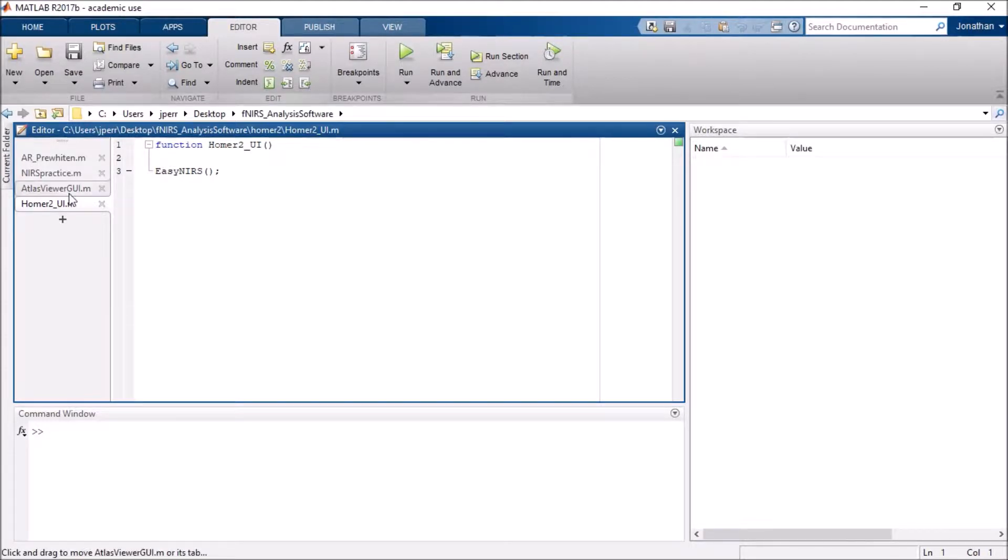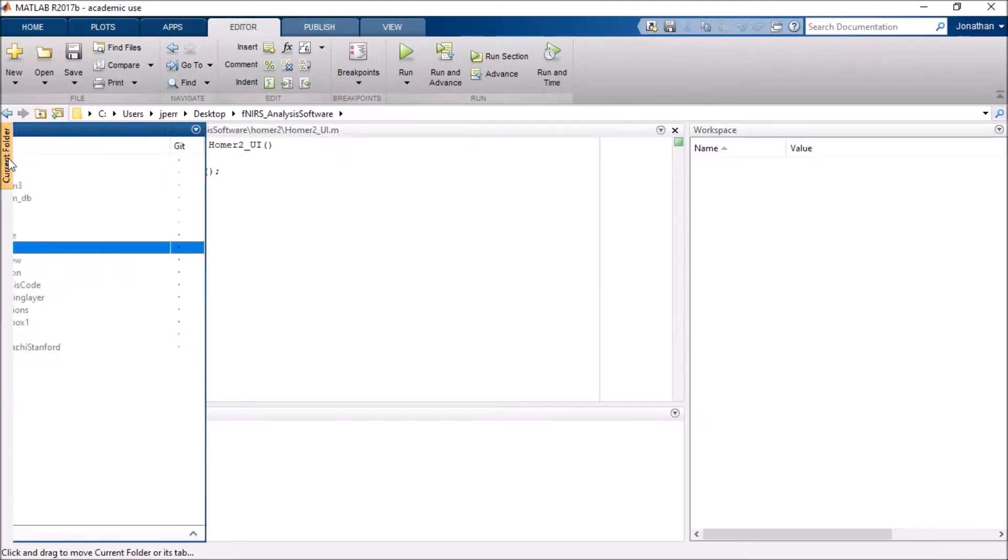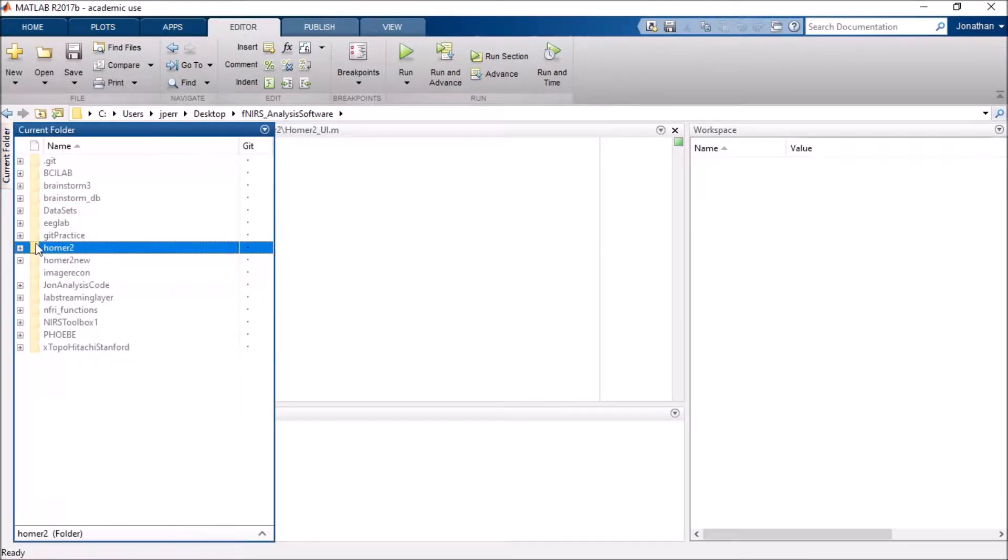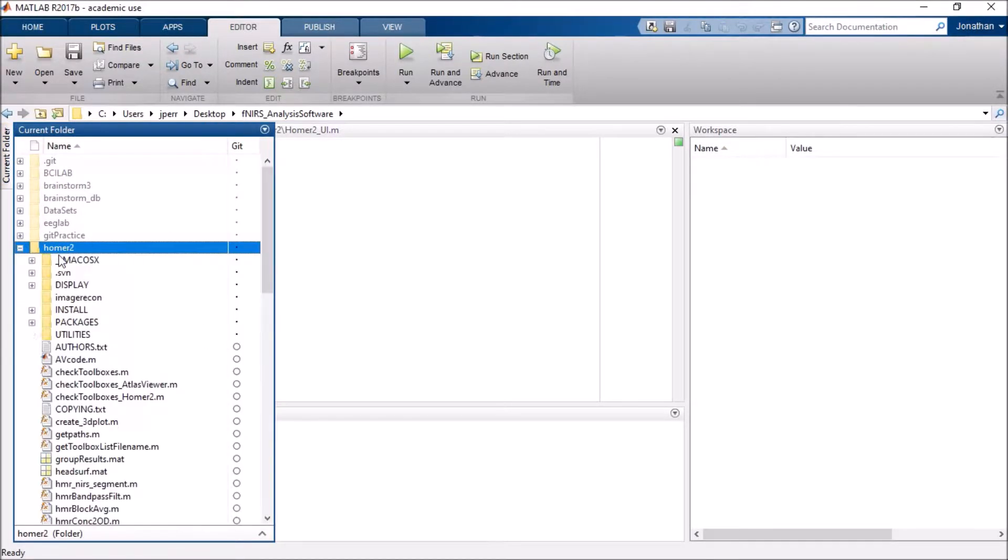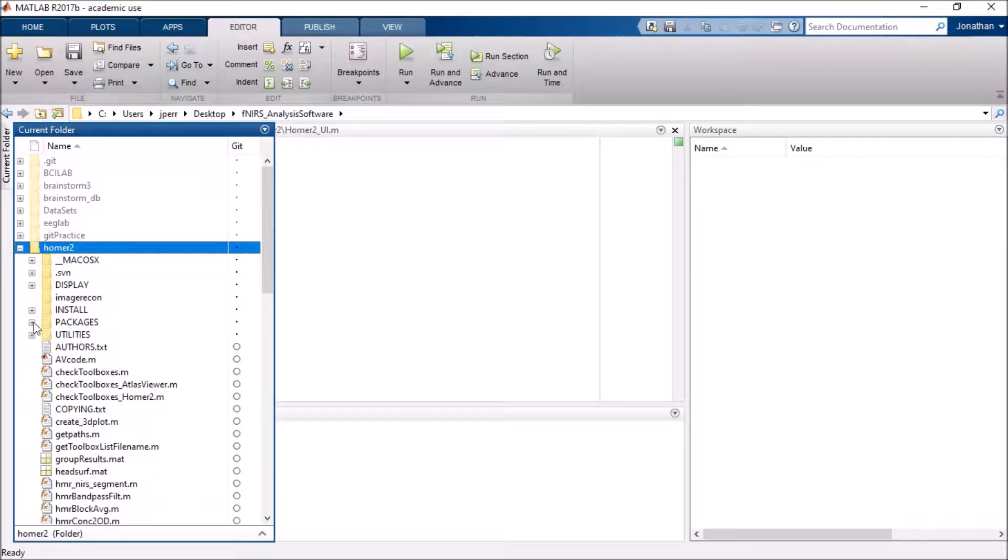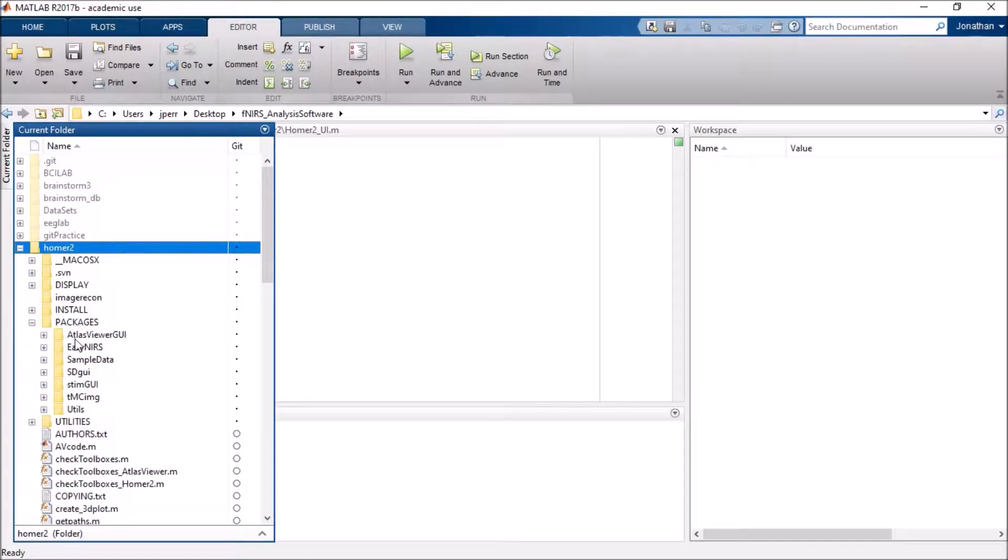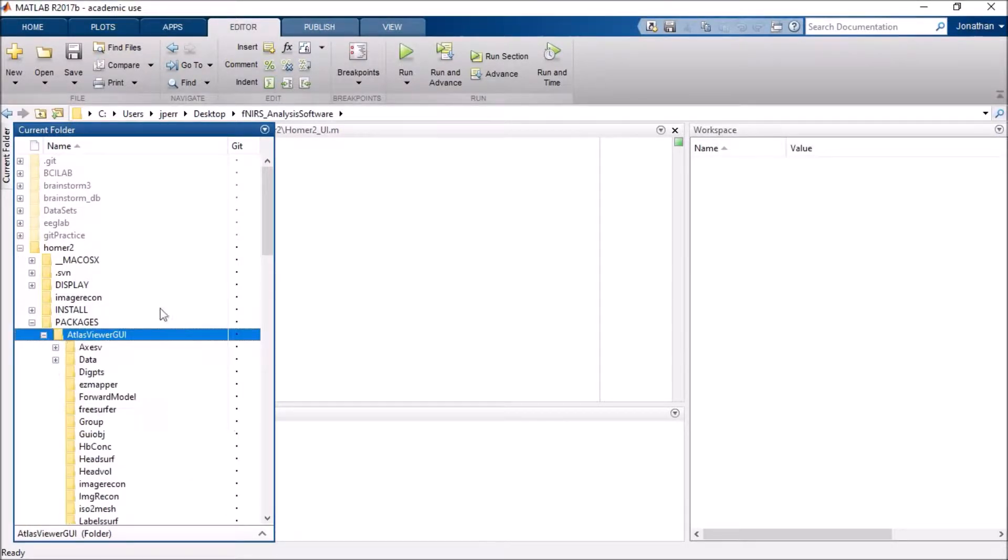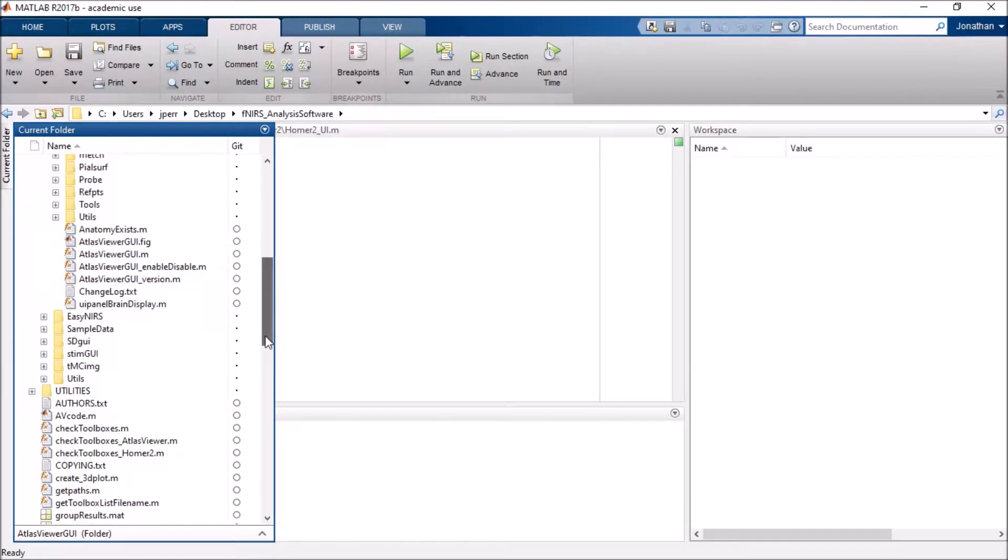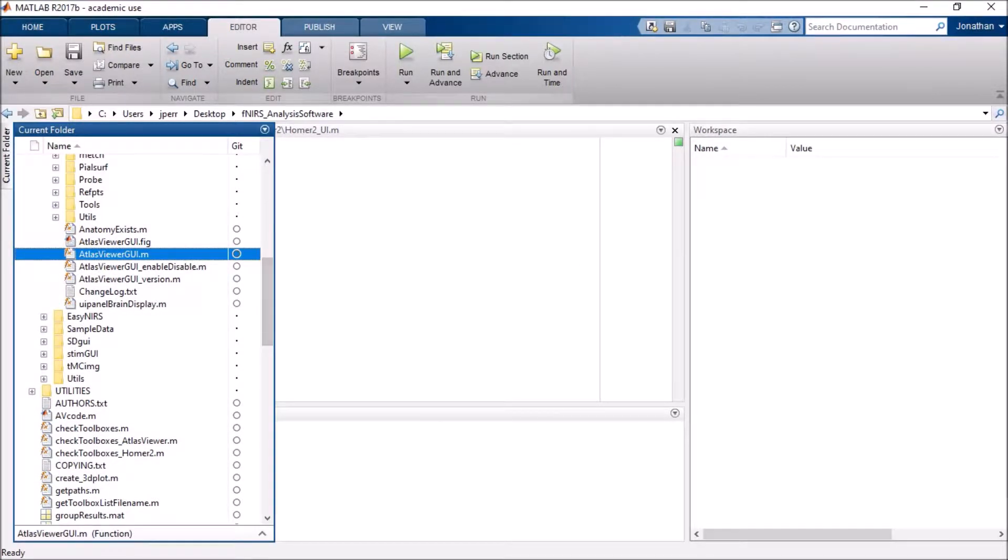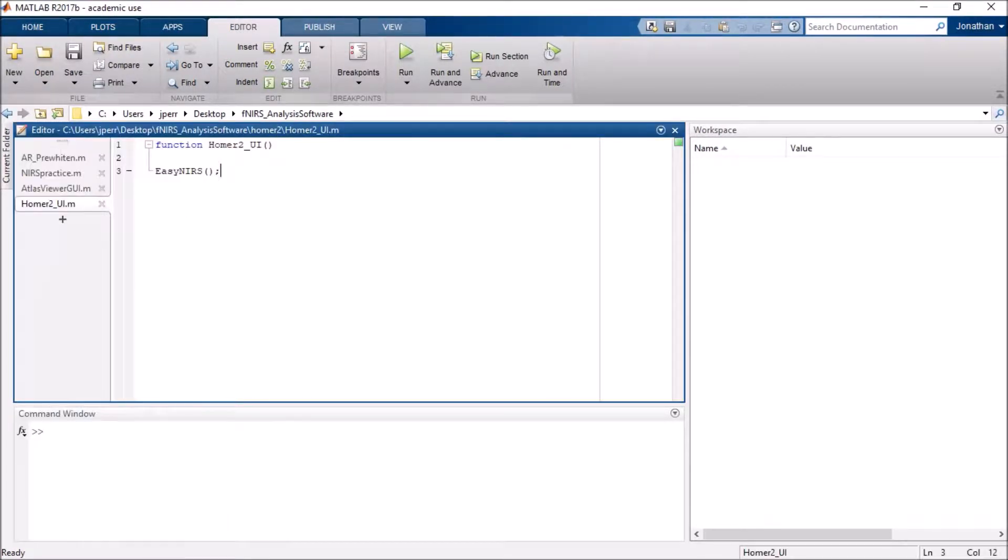First, I do have Homer2 and Atlas Viewer open in MATLAB. I want to show you where Atlas Viewer is located. If you go into your Homer2 folder, go to Packages, and Atlas Viewer, you will find an atlasviewer.m file, which is what I'm going to run to open up the GUI.